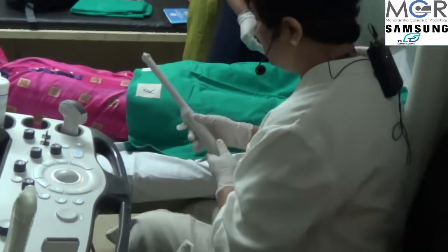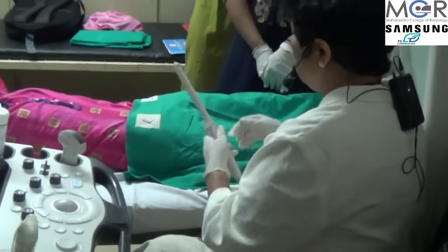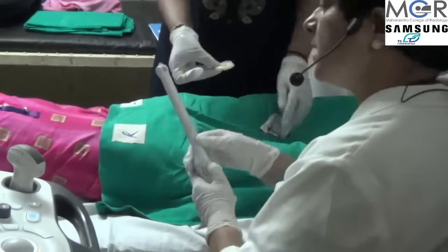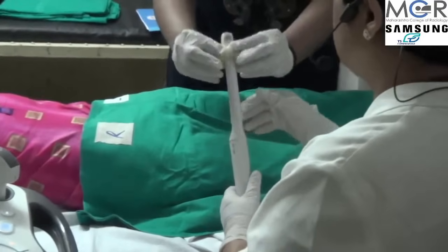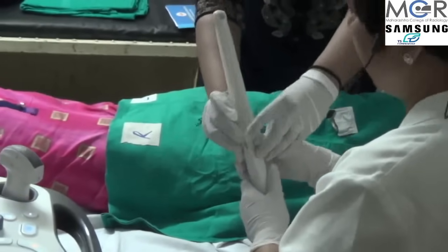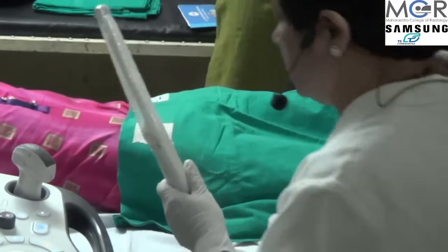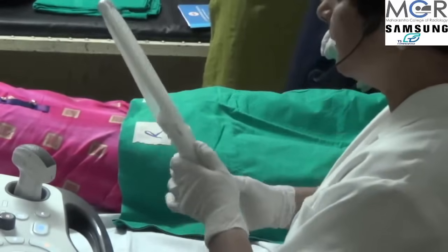First we should understand how to hold this probe. We put some jelly and then apply it. Jelly has already been applied and now we put a condom on the probe. It is essential to put a condom on the transvaginal probe so that no infection goes from one patient to the other. This should ideally be done in the presence of the patient so that she knows a new condom is being used.